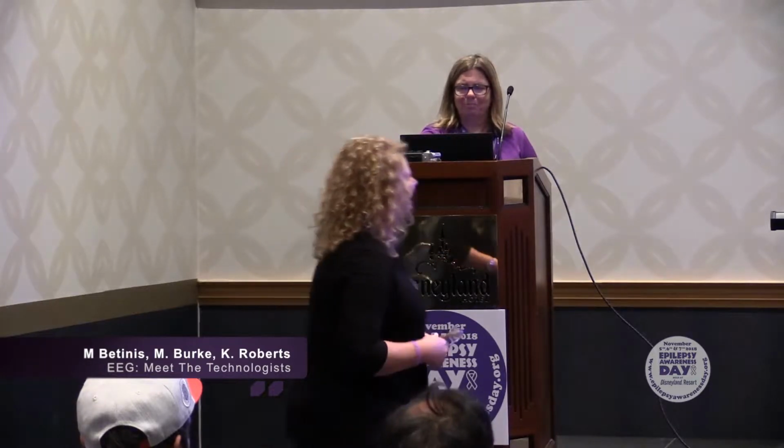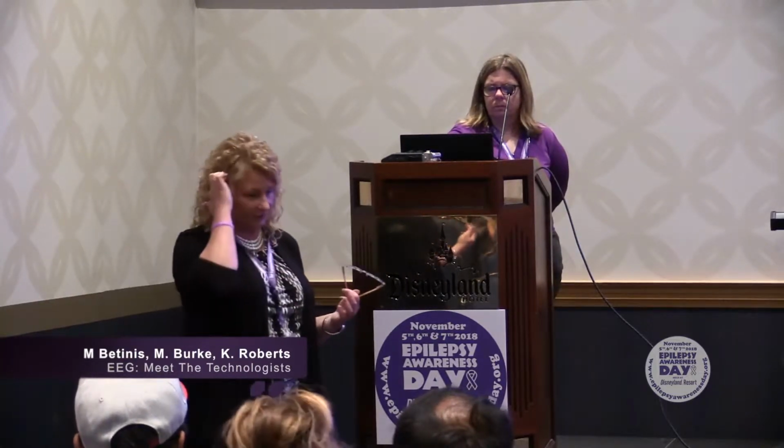Thank you. Some of the things that you would think about after having an outpatient EEG or a routine EEG, a physician may say, okay, based on what you're telling me, we may need to go a step further and have long-term monitoring or have an ambulatory EEG. And with that, you may either come back in and be admitted to an epilepsy monitoring unit, where, if you're on medication, you may have some of your meds decreased. You're maybe in an environment where there's a nursing and technologist EEG and video recording 24/7 to hopefully capture some of those events to see if we can correlate those and help better diagnose.